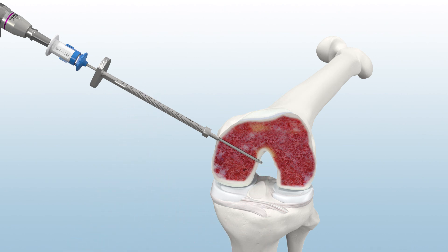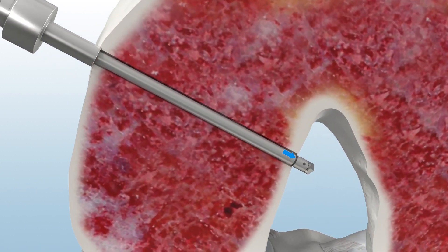Then, remove the guide body and arm from the joint. Confirm that the laser mark on the reamer's distal tip is exposed, indicating it's safe to flip the Retro Reamer tip.